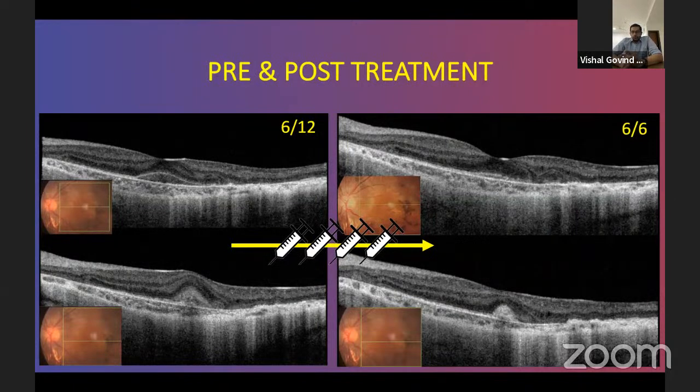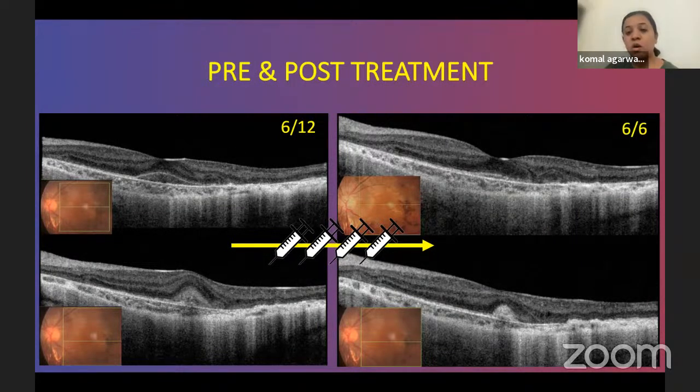Yeah. So just on the discussion of using an FFA or an OCTA in cases like this, do you feel that OCTA has an edge over FFA? It is unrelated to this choroideremia, but especially in cases of BEST where you already have some vitelliform deposits, it sometimes can get difficult for us to know where is the CNVM, where is the deposit, where is the scar which is going into the atrophic phase. Do you feel OCTA has an edge over FFA in these cases?